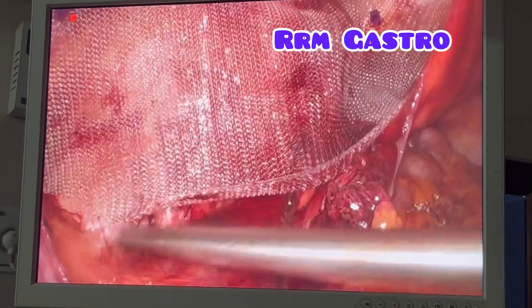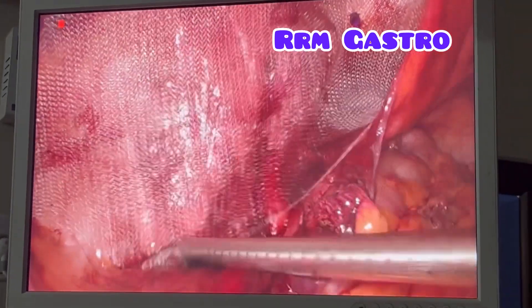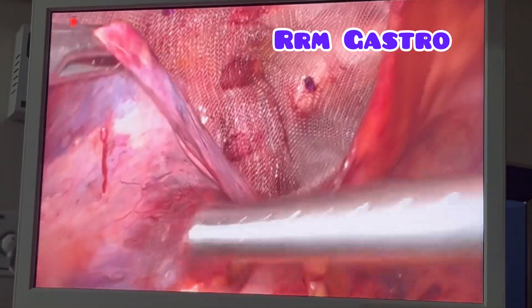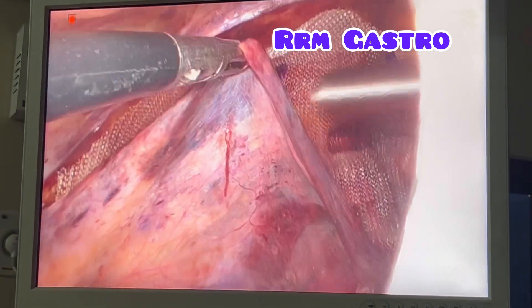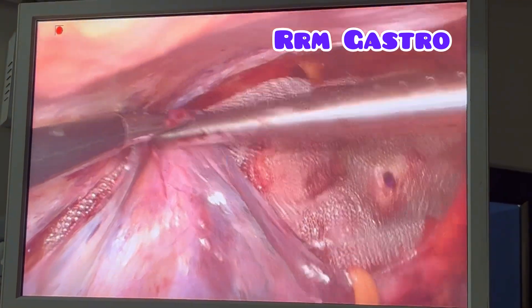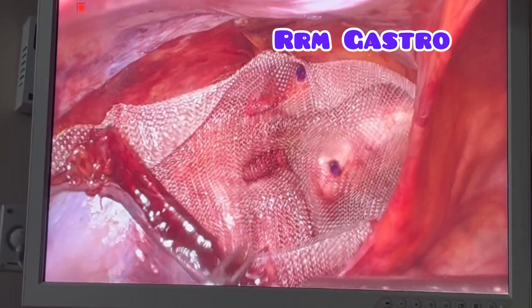This is a classical TAPP repair. I am dissecting and keeping the mesh so that it will not roll up. Now I am going to close the peritoneum using the same tacker. This is a method of closing the peritoneum. We can do sutures also, but by using a tacker it saves time — one tack, one tack.